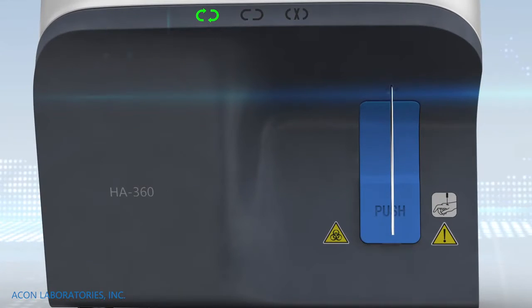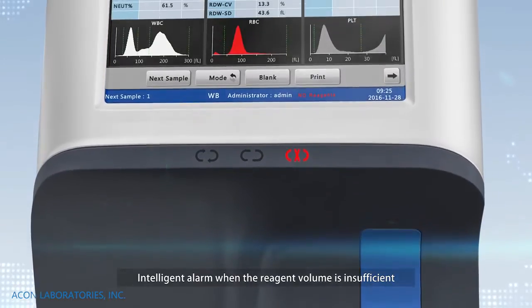Fast operation. Intelligent alarm when the reagent volume is insufficient.